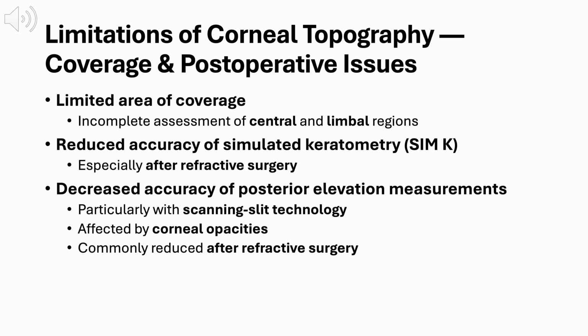Topography is also less reliable for evaluating posterior corneal elevation. This is particularly true for scanning slit-based technologies, where accuracy can be affected by corneal opacities and changes in light transmission. After refractive surgery, posterior elevation measurements are commonly degraded, making it harder to accurately assess posterior corneal shape and stability using topography alone. The overall takeaway is that while corneal topography is invaluable, its limited coverage and reduced accuracy in the postoperative setting mean it should be complemented with other imaging modalities when detailed or posterior corneal assessment is required.